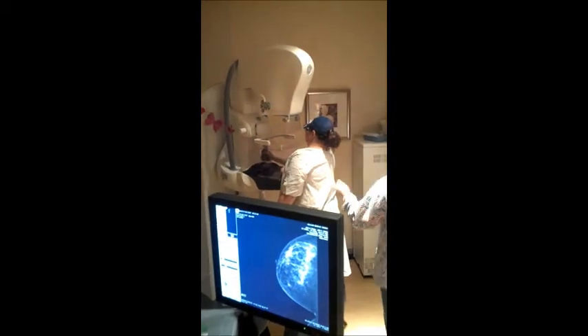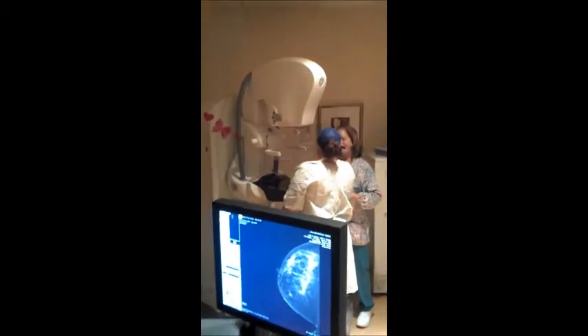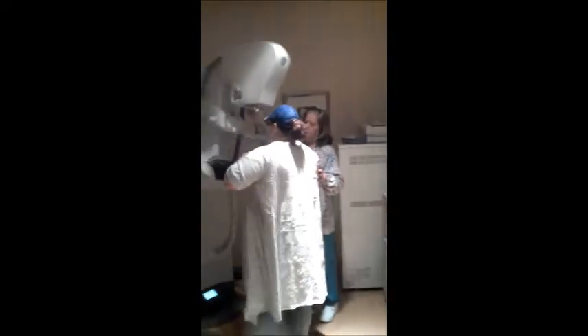Dana, doing great, only two to go. How are you doing? Alright? The machine's going to turn. You're far enough away.